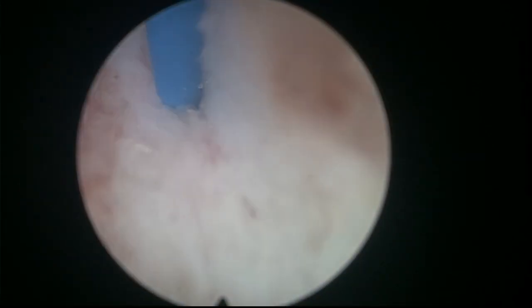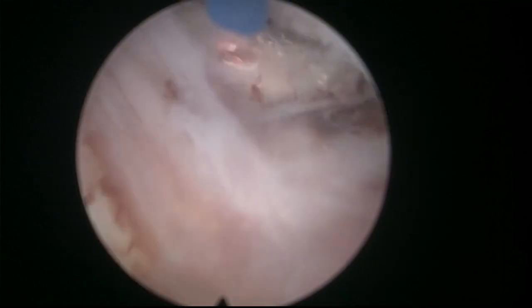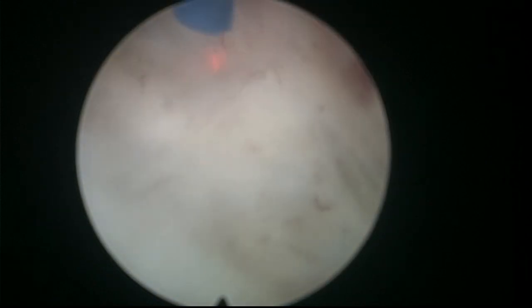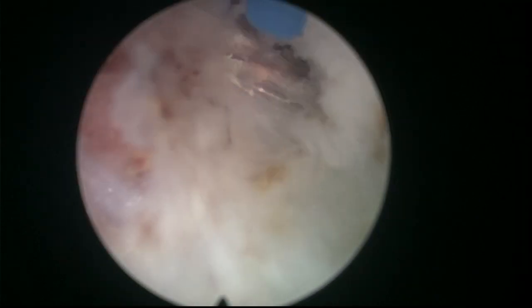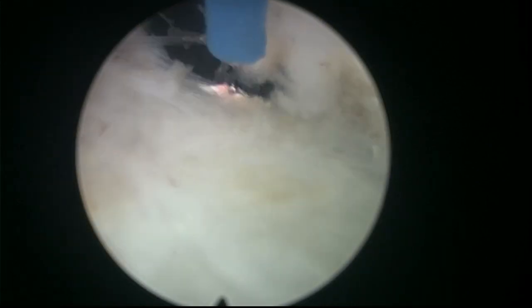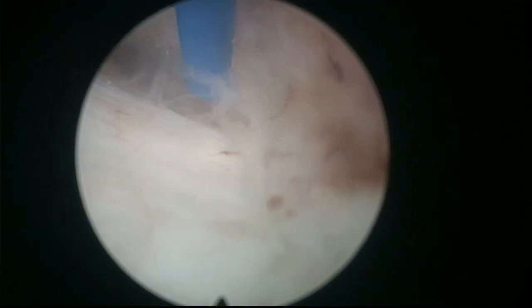But I think here we're talking about something more universal. I think the concept of starting by liberating the sphincter first is a very valid concept. The concept of having excellent irrigation during the operation, because we are irrigating a restricted space, is very solid. Despite the fact that this hasn't received enough attention for the moment, I think the message is strong, and more and more people are learning this approach. And the more they do it, the more enthusiastic they are about it.